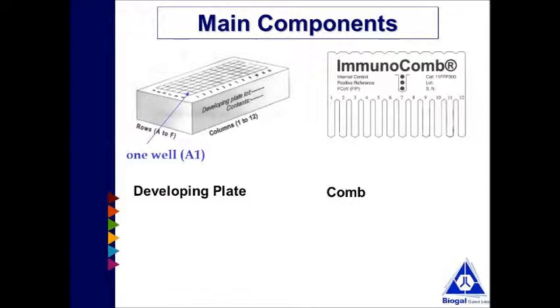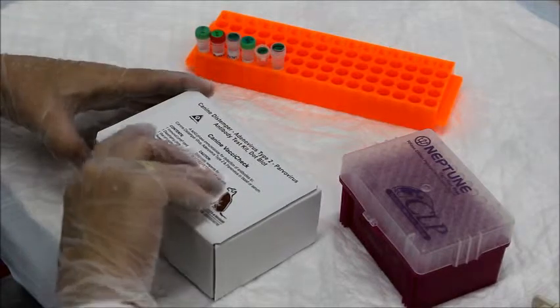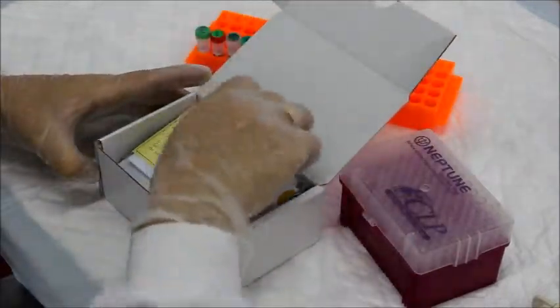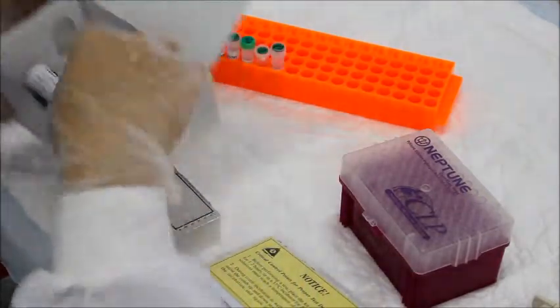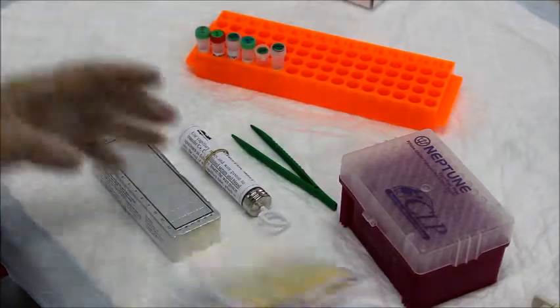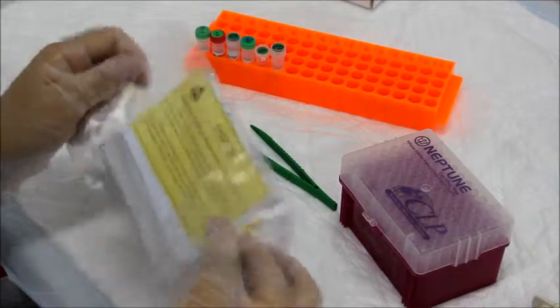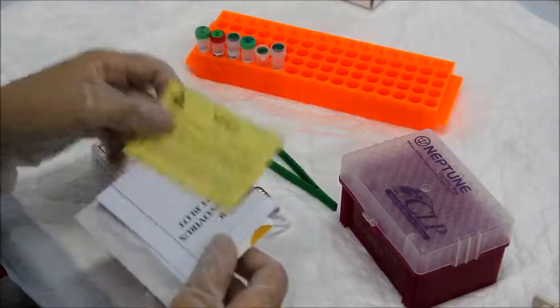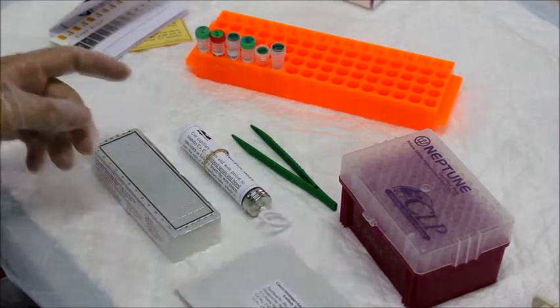The components for the kits are as follows: ImmunoComb comb wrapped in aluminium foil, developing plate, disposable tweezers, calibrated comb scale, and a unit of capillary tubes and one piston. Instruction manual. So let's go through this process step by step.